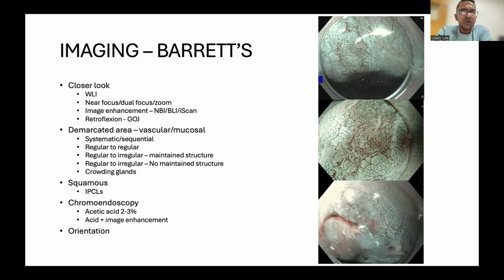After you take a step back and look, that's when you want to take a closer look. This is when you use your imaging modalities. I try to convince you that you don't need the highest generation, top-end high-tech scope with 4K definition to image these patients. Rather, be familiar with what you have.